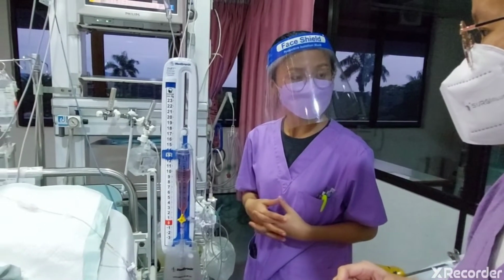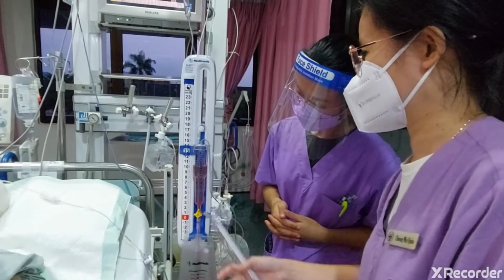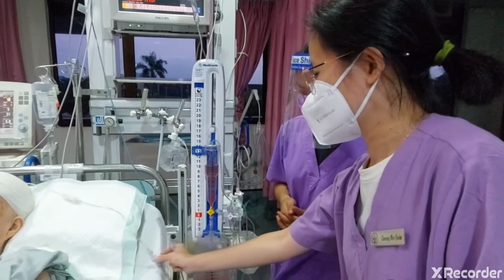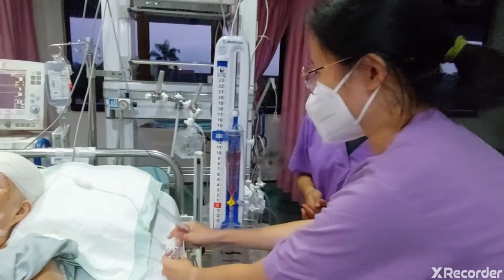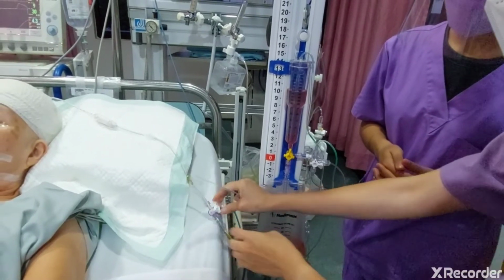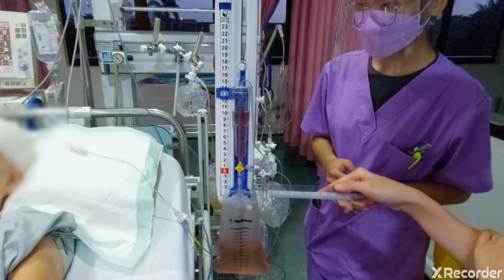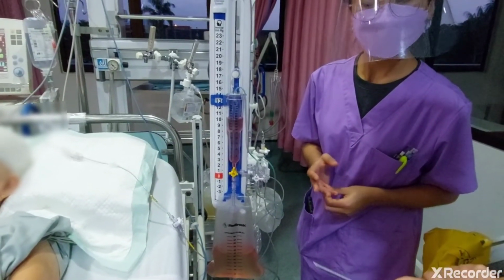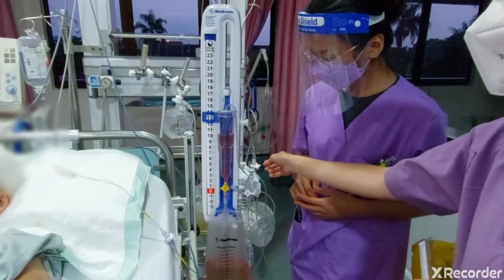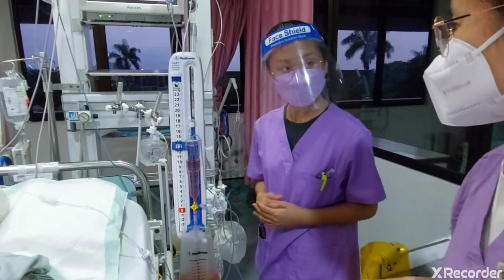So the complication is, let's say when we need to put up the patient high, it's a conscious patient, so we need to close the drain when the patient is put up high, to avoid excessive drainage of the CSF. It will cause a ventricular collapse and cause a subdural hematoma. Then the second thing is infection. Every time you do zeroing, we need to hand swab and then use the alcohol swab to swab the opening. Okay, understand? I can understand.